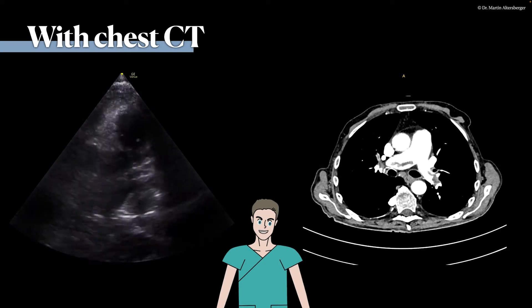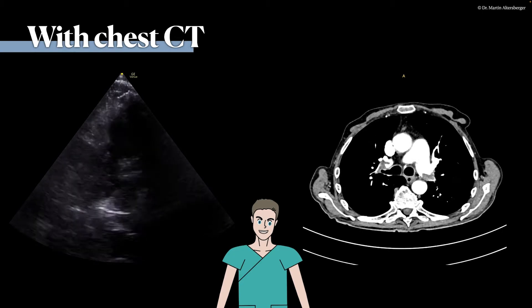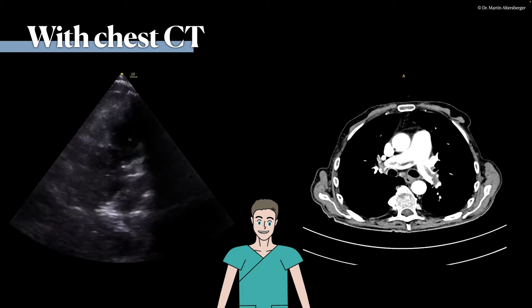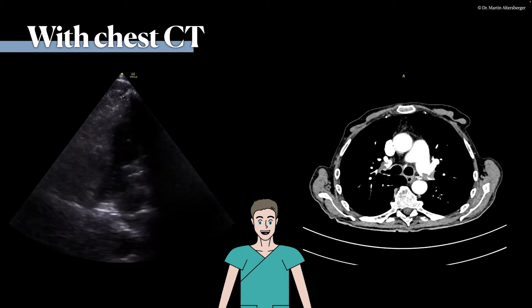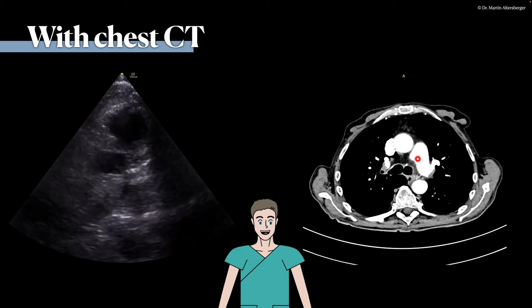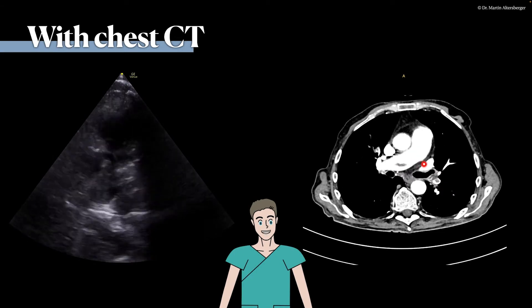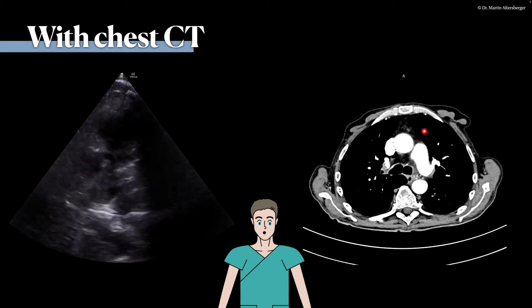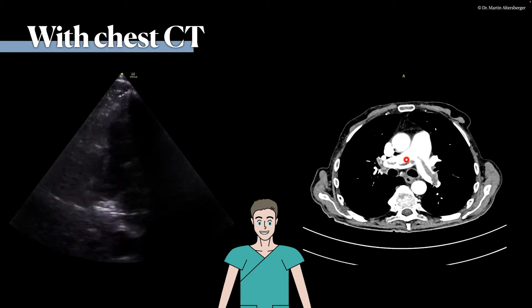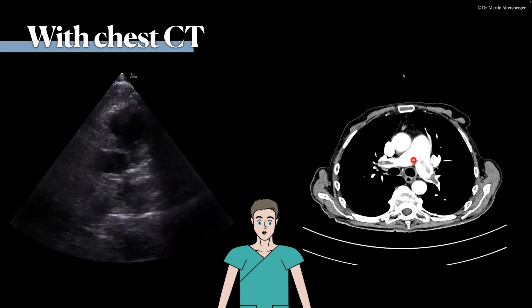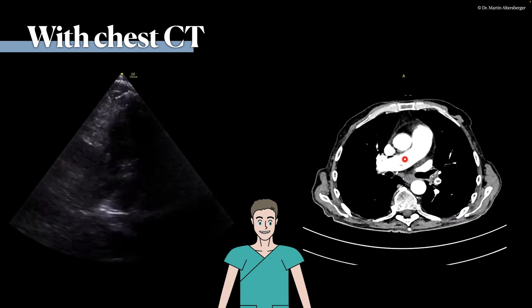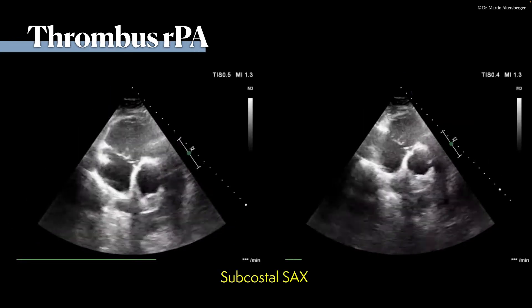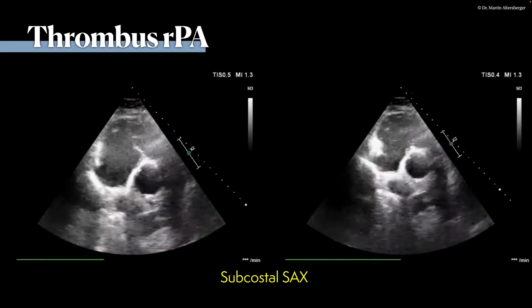Be aware that over-gaining might help, but also be aware it could be a pitfall — you may be over-interpreting a higher gain as a possible thrombus. In this case, it was proven by chest CT that there truly is a central pulmonary embolism. Here we have parts of the aorta, the pulmonic trunk, the right and left pulmonary arteries, and the thrombus.